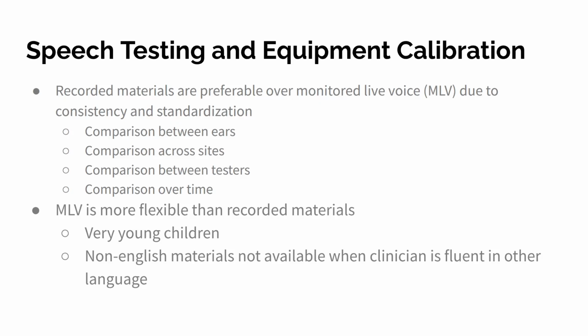So just as an example, say we're doing a speech recognition threshold test and we want to eliminate certain words that are not in the vocabulary of a non-English speaker. We can do that very easily using monitored live voice presentation. Same thing with very young children. We can use just a very limited set of words for a speech recognition threshold. It's much easier to do it monitored live voice than it is for a recording, where we have less flexibility.